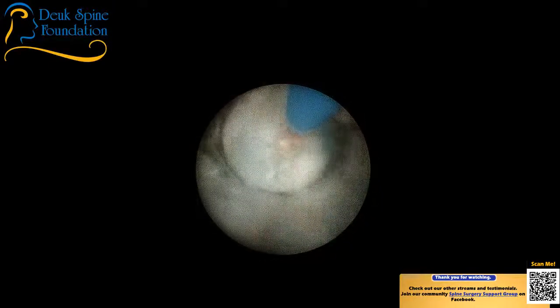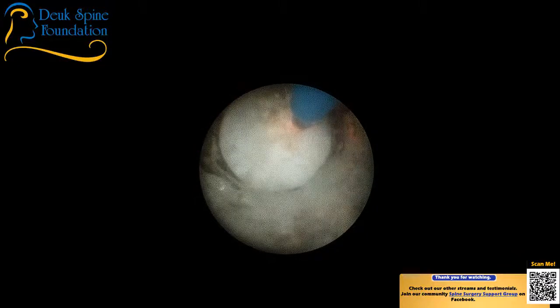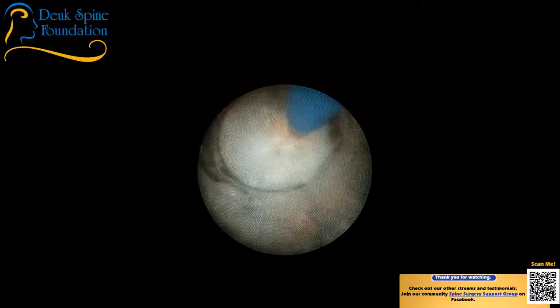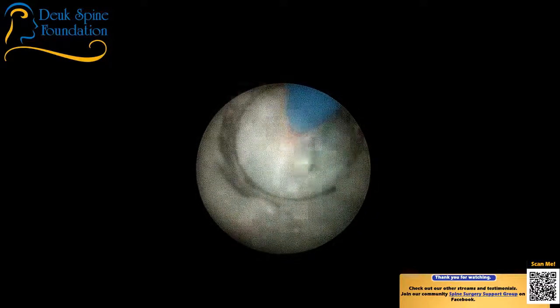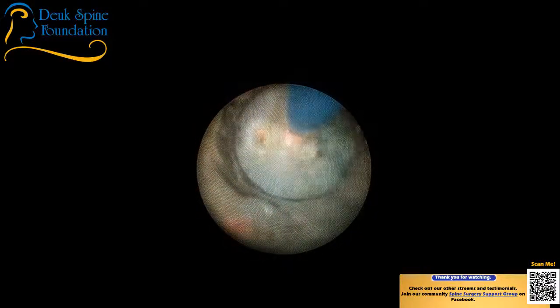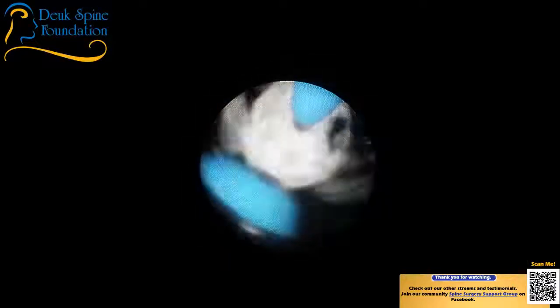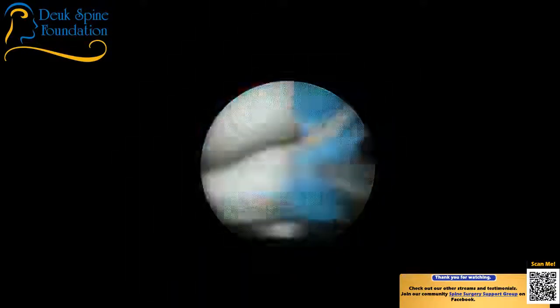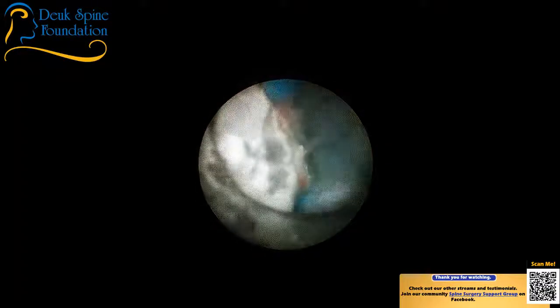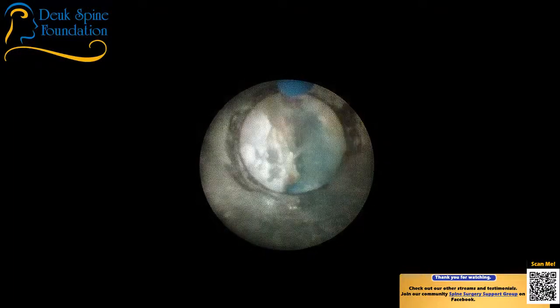And that's why a lot of people get reherniated discs. If they follow the instructions and they get a reherniated disc in their back or something, usually it's because the debridement of the annular tear wasn't done. It has to be done properly. If the annulus is debrided, then the disc will heal. For the disc to heal, the annulus has to reattach both sides of the tear. You understand?